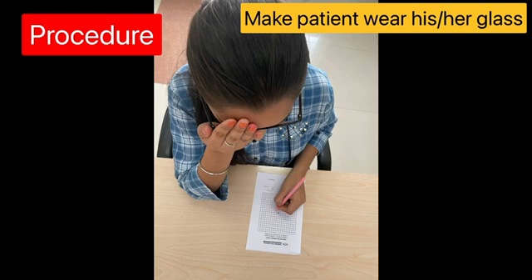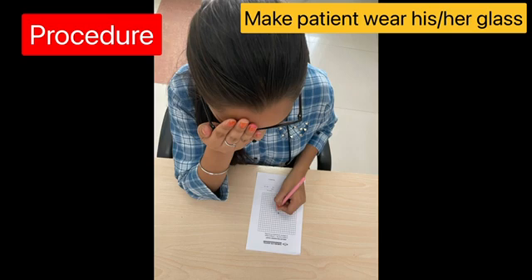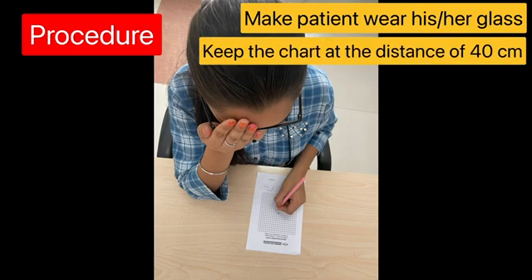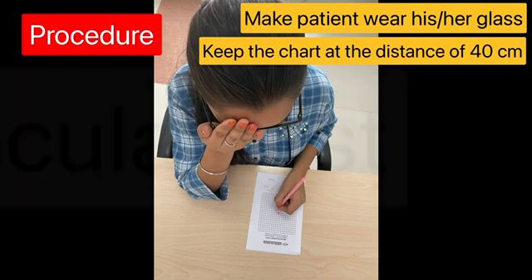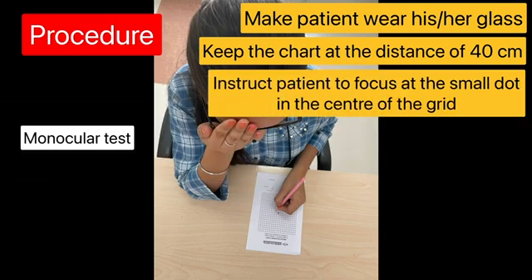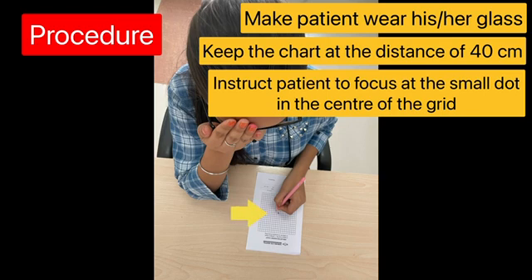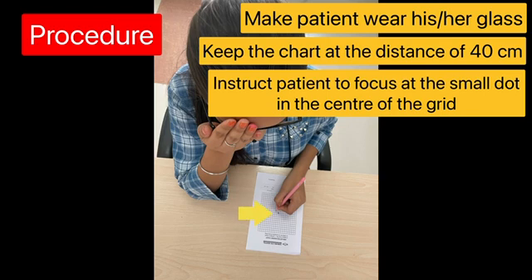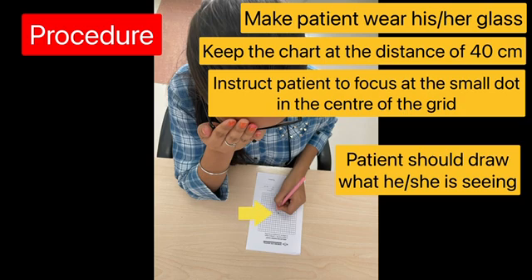While performing the test, if a patient has any glasses they should be made to wear them during the test, and the chart should be held 40 centimeters or 16 inches away from the eye. Patients should look with each eye separately, as this is a monocular test. Patients should also be asked to focus at the center dot, which is a small dot in the center of the grid.